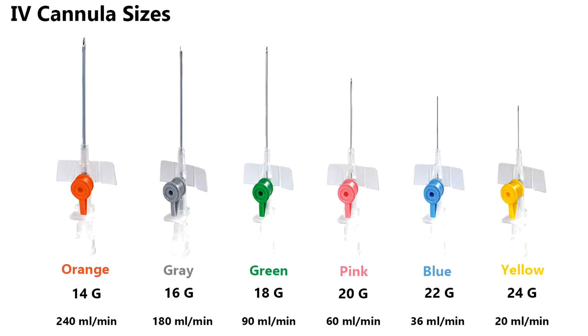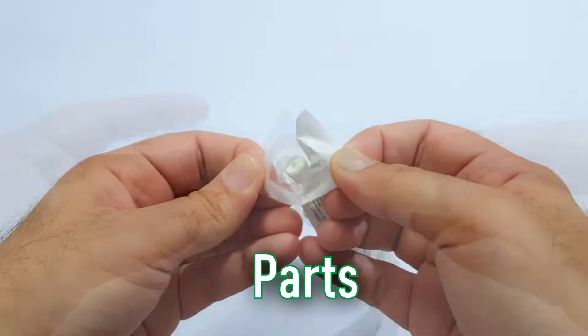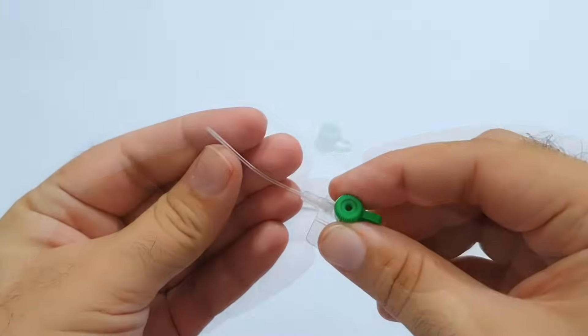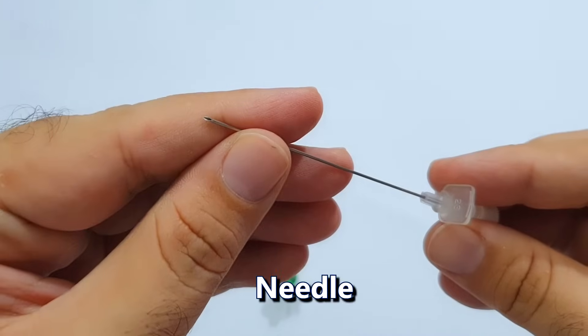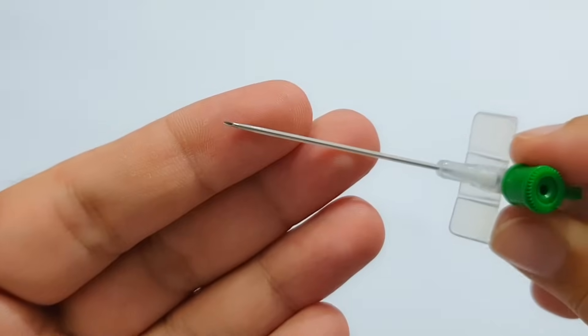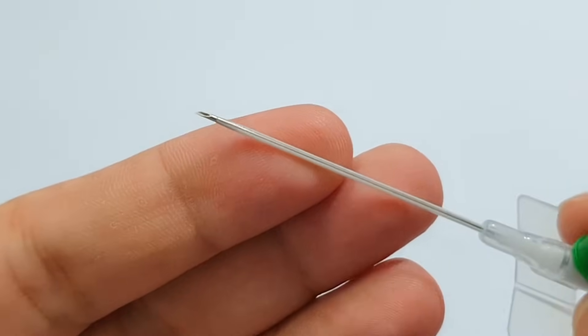Here is an IV cannula of size 18g which is of green color. Open it like this — these are its wings which you can make straight. It has a catheter which is flexible and blunt. Inside the catheter is a needle which is sharp and non-flexible. The needle is present inside the catheter in such a way that the pointed end of the needle is protruding from the end of the catheter so that it can penetrate the vein.